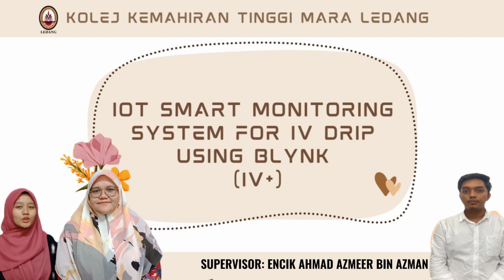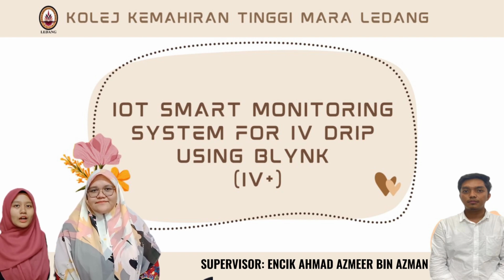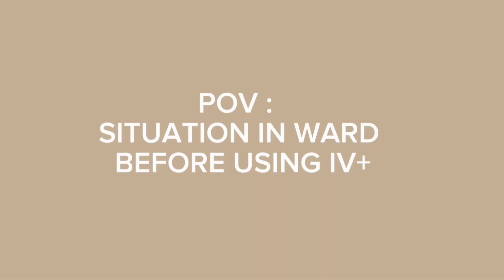We will present to you our project, IoT Smart Monitoring System for IV Drip using Blynk IV+.